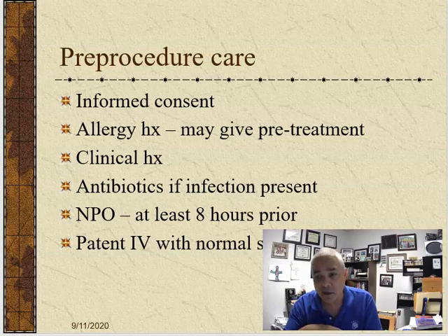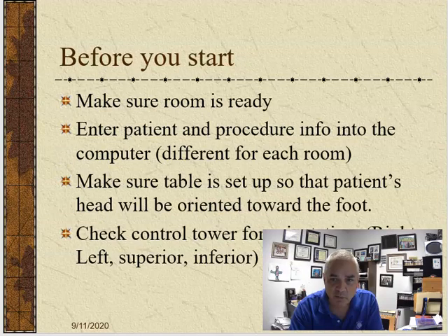Anyways, just in case this person starts to hurl, it's better for us if they don't have a big Bojangles breakfast on board. It makes it easier to clean up if they've been NPO. And of course, they're going to need an IV started so that we can push meds along the way. And once upon a time, we had to set the room up ourselves whenever they did ERCPs in the department.